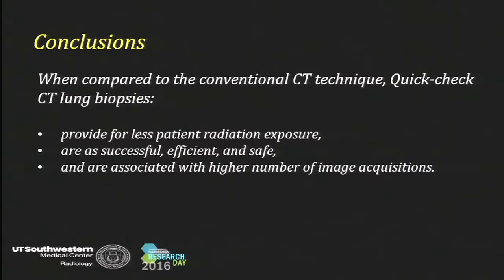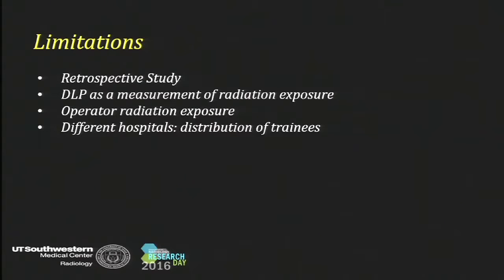Now, we conclude that when you compare to the conventional CT technique, quick-check CT fluoroscopy-guided lung biopsies provide less radiation exposure to the patient. They're as successful, efficient, and safe, however, they're associated with a higher number of image acquisitions to get to the lesion. We believe that this last factor is actually dependent on a couple of things which we couldn't address due to the limitations of the study.